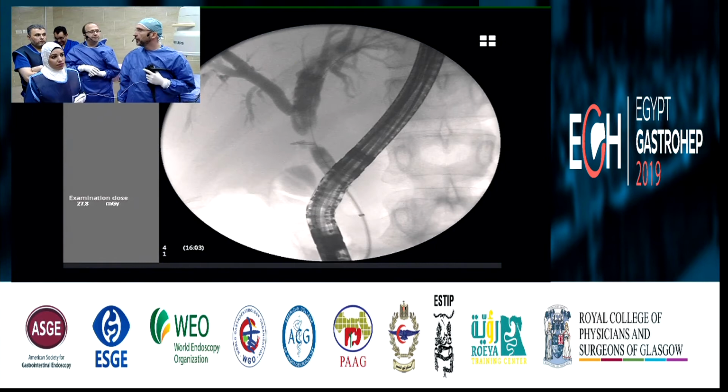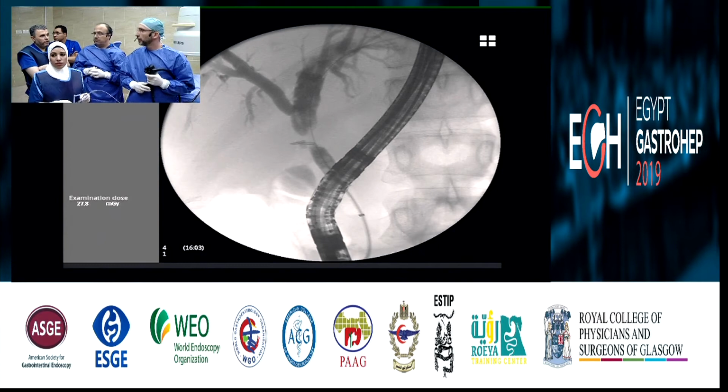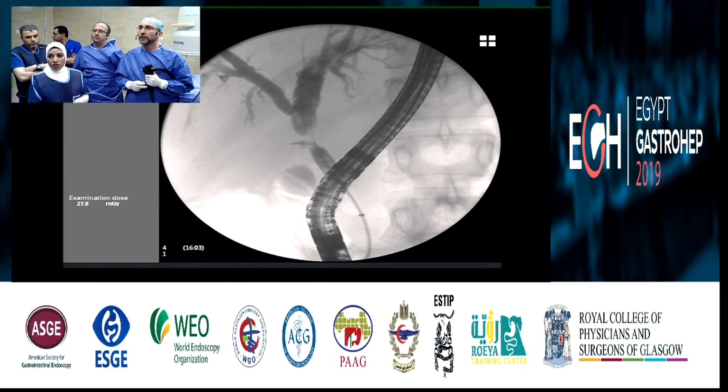Without balloon dilation. I would balloon dilate. Then dilate minimum 6. We leave the fully covered metal. Yes, we'll have one wire on the plastic and make it go parallel. You prefer to place now multiple 6 millimeter plastic stents, or better a 6 millimeter metallic stent? 6 millimeter is okay.